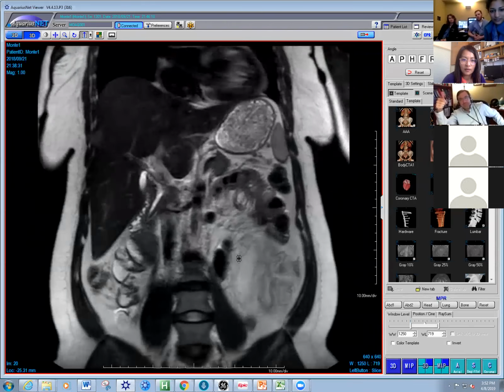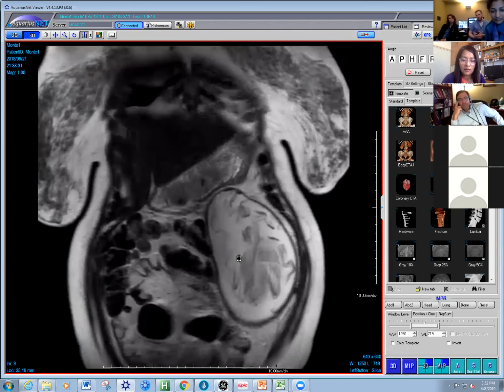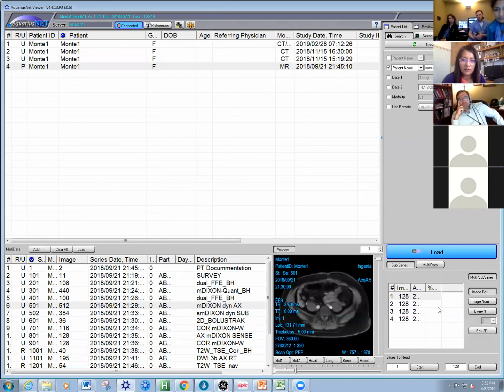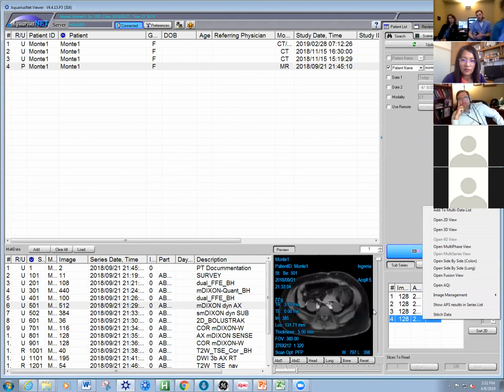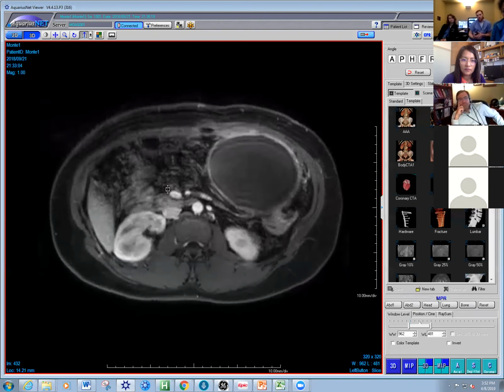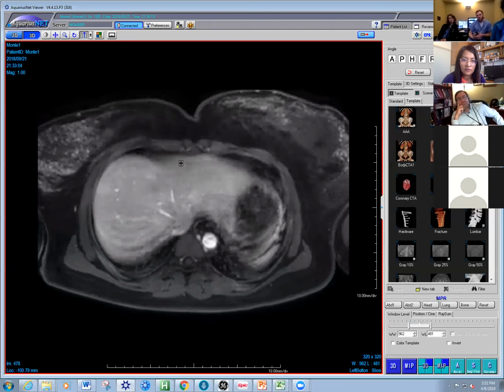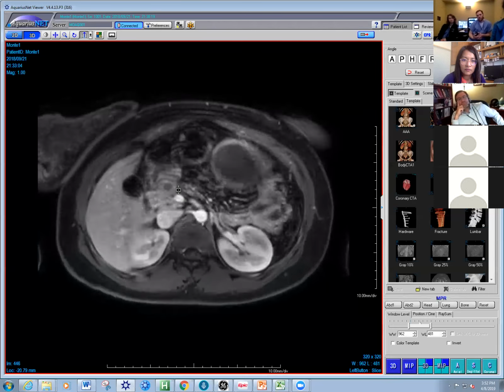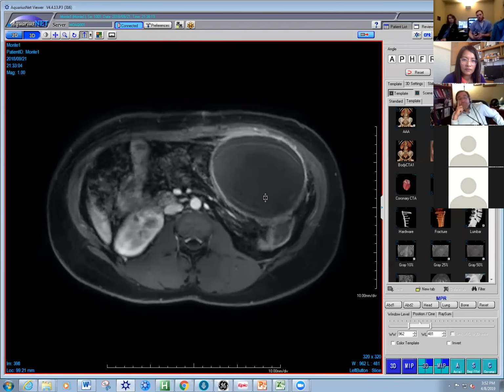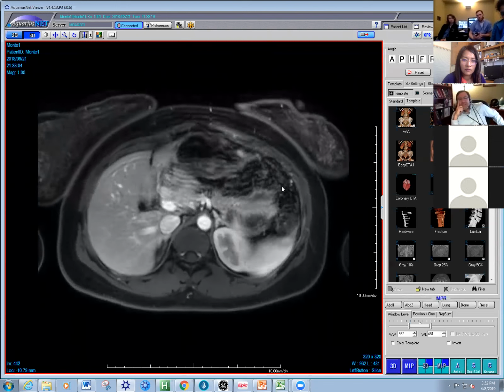Right. So this is a cool case of Gossypiboma on MR, but the peer learning aspect of it is the following. This is not my case, but it might as well have been, because I'm guilty of it all the time. You look at the impression very carefully to make sure things are done correctly, but then you skim through the body of the report. In this case, the impression said Gossypiboma. It was spelled correctly, but in the body, the text was unedited and it said classic hygroma.